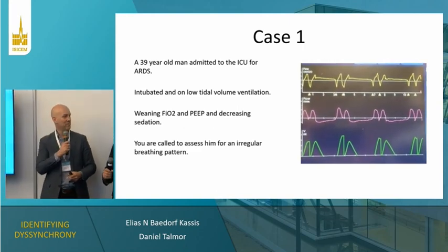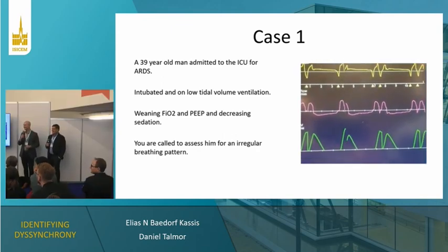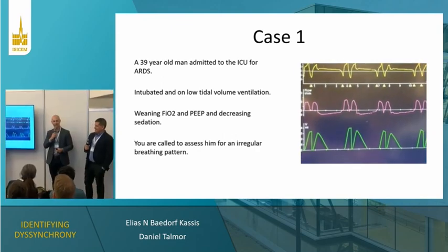I kind of hear a little... Yeah, you have to speak a little. Murmuring and mumbling. Double triggering, exactly. All right.